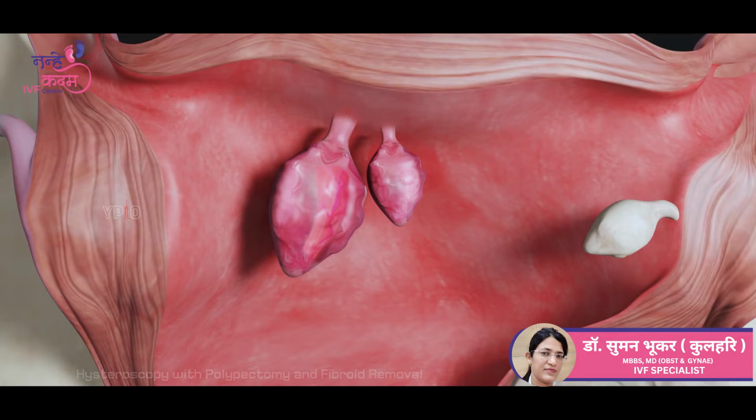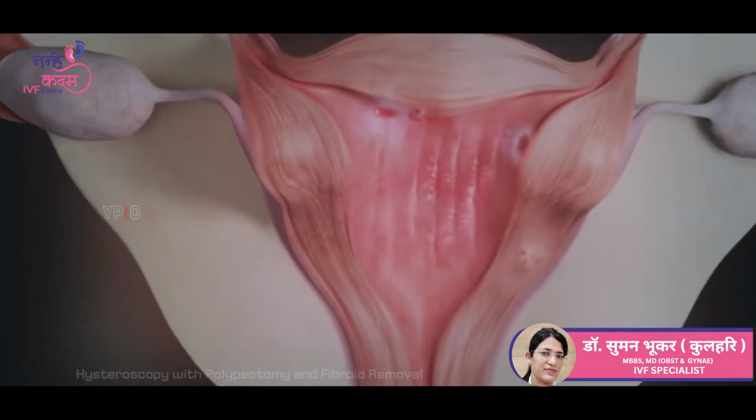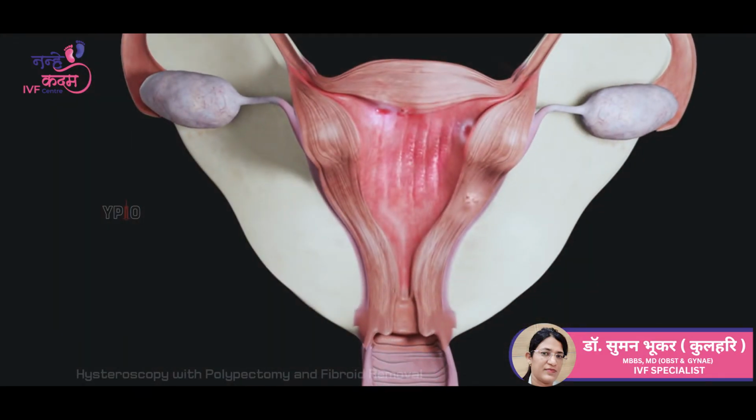Miniature surgical instruments are passed through the hysteroscope to remove any polyps or fibroids present. After the polyps and fibroids are removed, the scope and instruments are removed.